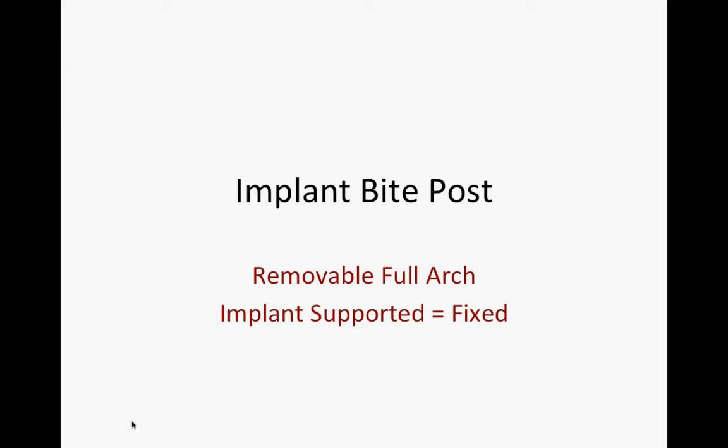But in the case of dentures, most sore spots are developed from poor occlusion, and they're not typically from a poorly fitting base. So if you're going to err at all, the impression might not be as good, but the bite's got to be good and repeatable. So in the case of upper and lower complete dentures, we can do a post-insertion clinical remount, and then equilibrate the dentures.